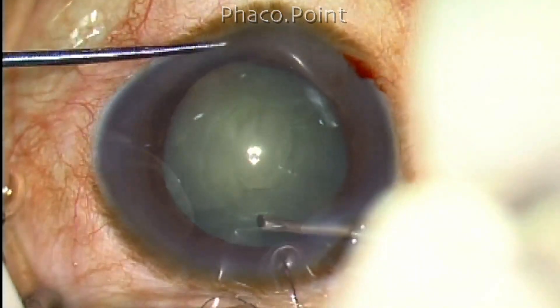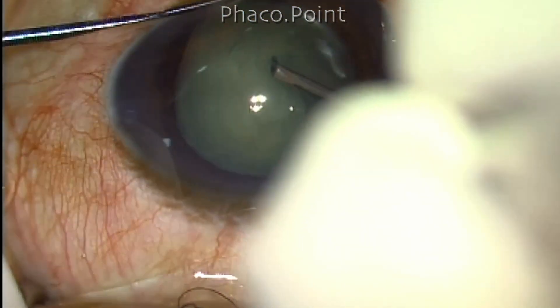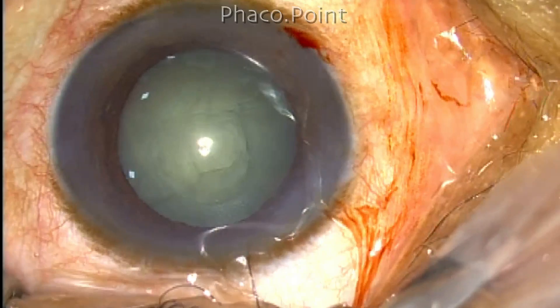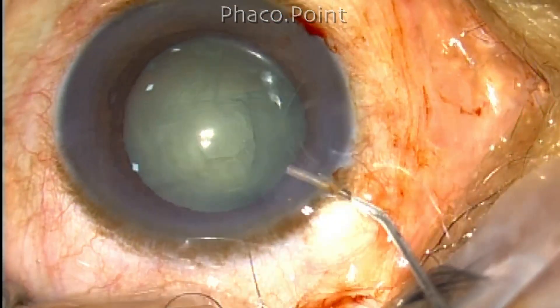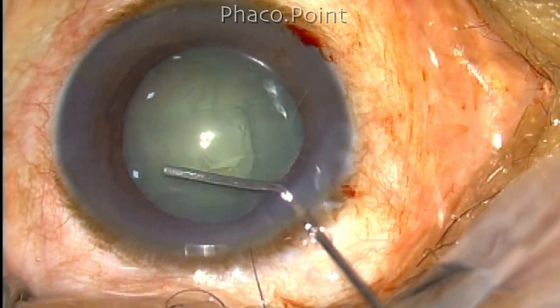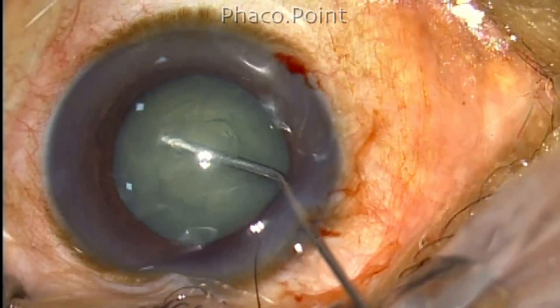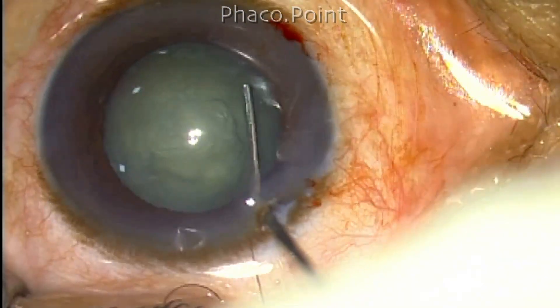Once the capsulorexis has been completed, note the hydrodissection procedure. In this case, I am using a round cannula because my usual hydrodissection bevel cannula was not available — this is a 27 gauge round cannula. The fluid flowing out of it will pass in a horizontal direction, and even if you pass it underneath the peripheral edge of the capsulorexis and inject, sometimes you may not get it in the right plane.